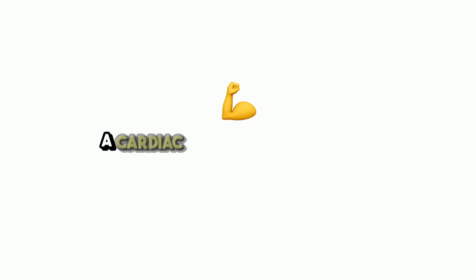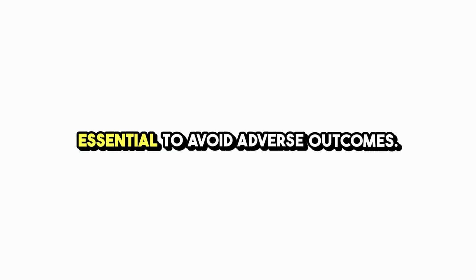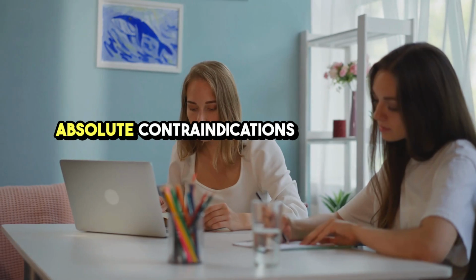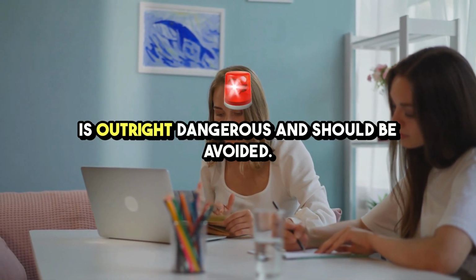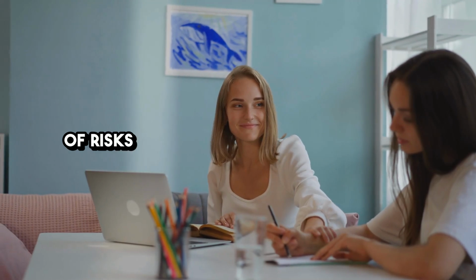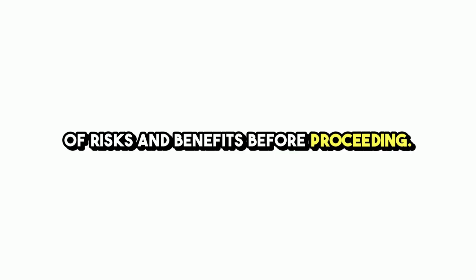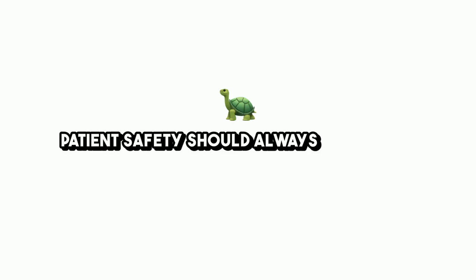In summary, understanding the contraindications for a cardiac exercise stress test is essential to avoid adverse outcomes. Absolute contraindications are situations where the test is outright dangerous and should be avoided. Relative contraindications require a careful assessment of risks and benefits before proceeding. It's always important that a healthcare professional evaluates the patient's overall condition to determine whether an EST is safe and appropriate. Patient safety should always come first.